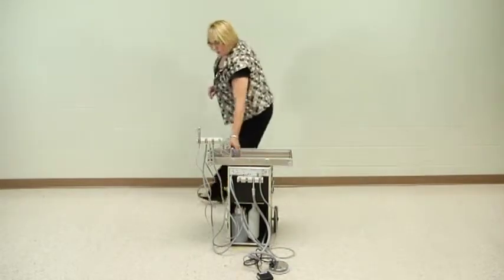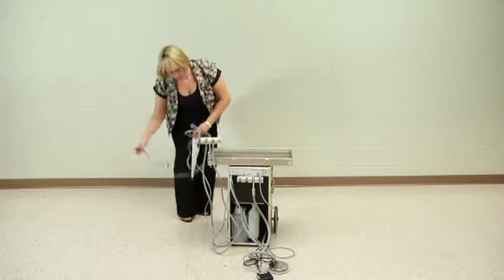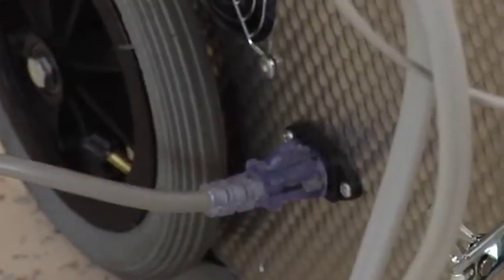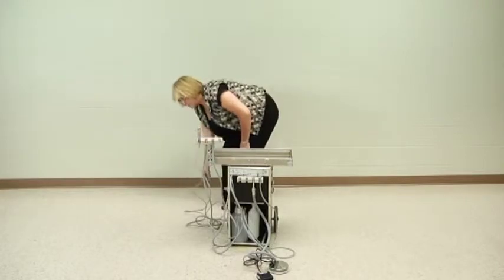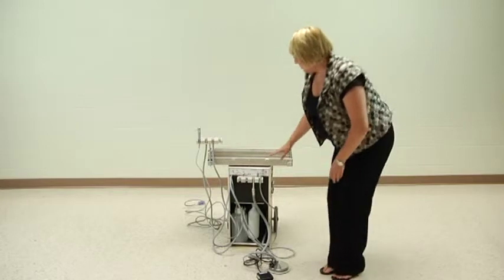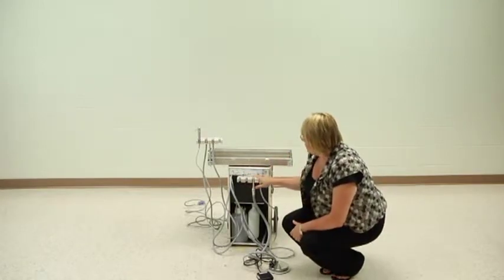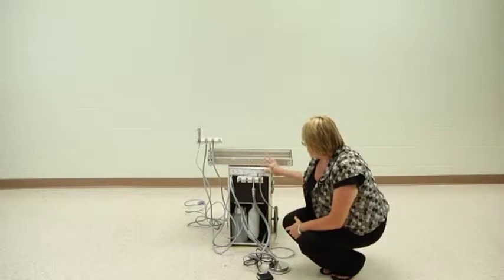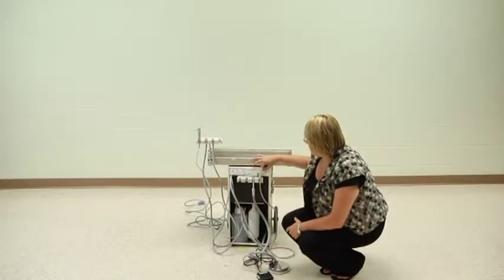The power cord attaches to the side of the unit towards the base and can just be plugged into a conventional power source. At the front of the unit, there are quick connects for water and air for your ultrasonic units, as well as a hand piece switch to go from one hand piece hose to the other.